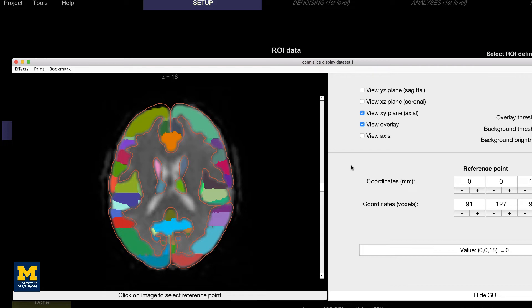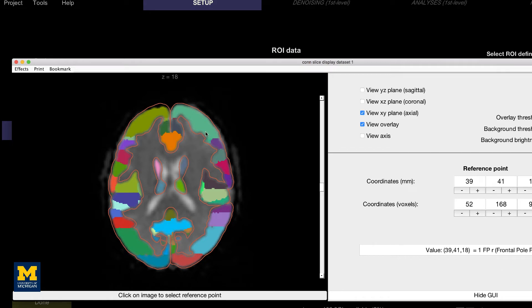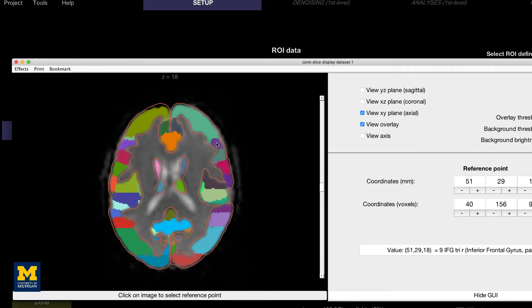For example, the parcellation colored in orange indicates the anterior cingulate. Hovering your mouse over the different colors and clicking will show which ROI you are pointing to. Later on, we will use these ROIs in our first level analysis to generate connectivity maps between those ROIs and all of the other voxels in the brain.